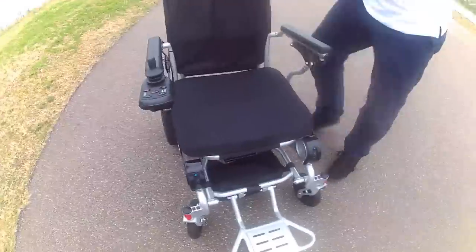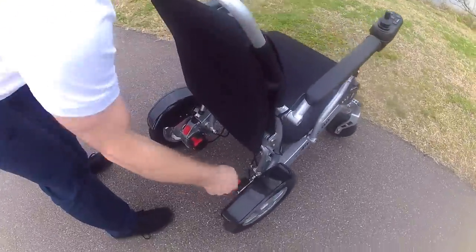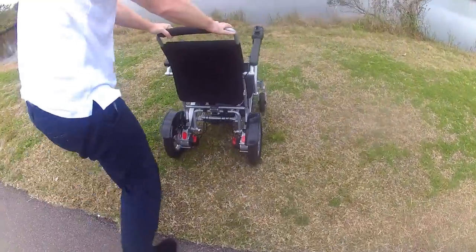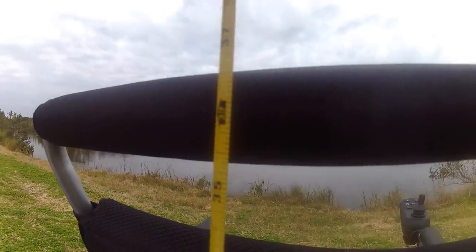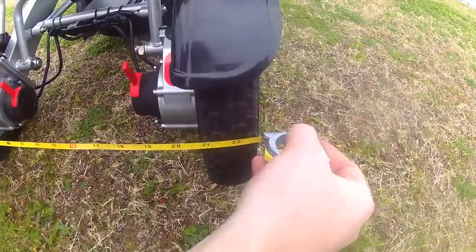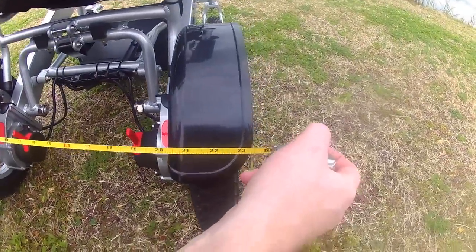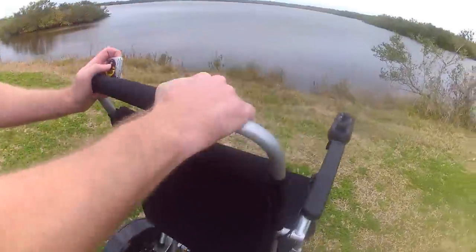Let's take a look at the back of the chair again. I'm going to put it in freewheel mode. From top to bottom, we're looking at just over three feet of space. From wheel to wheel on the back side, we're looking at just under 23 inches, and right around 23 inches on the casters — that gives you a good idea of the actual chair dimensions.